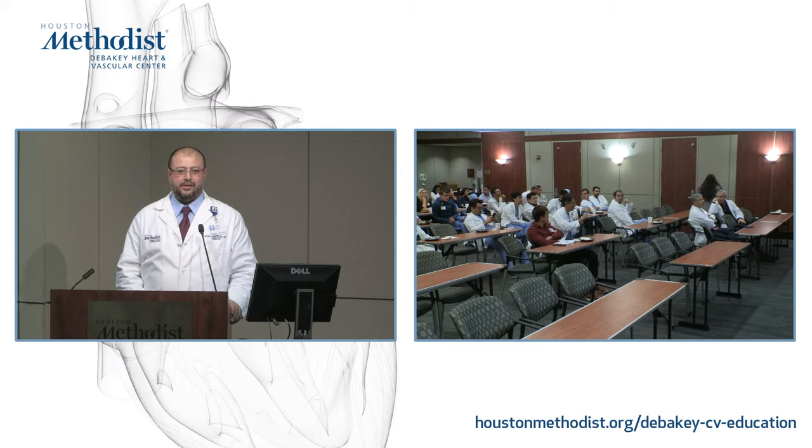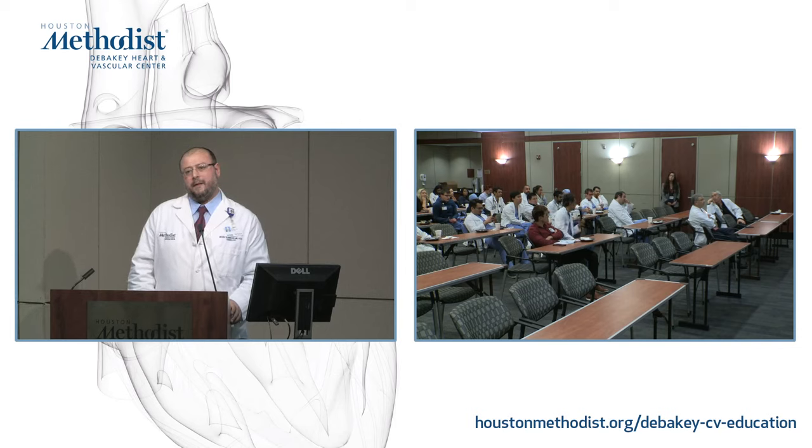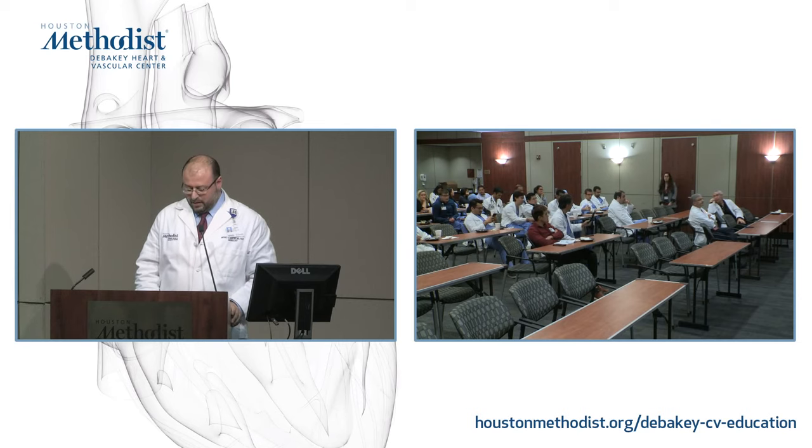SPECT could never have a 3D system, right? Because we would have no spatial resolution. With PET, you need two photons to hit each detector. Whereas with SPECT, the emission is coming from all over the place, and you wouldn't be able to resolve it. You need a high-resolution collimator, because otherwise you get all these scattered events and you have no idea where they're coming from. That's why you can do it in PET, because you always have the other photon. Exactly, you have to have two photons, and we're going to cover that in the radiopharmacy.